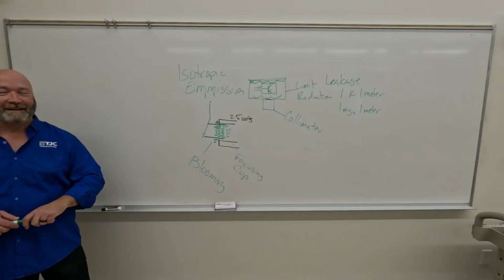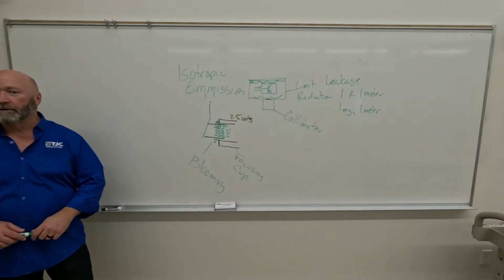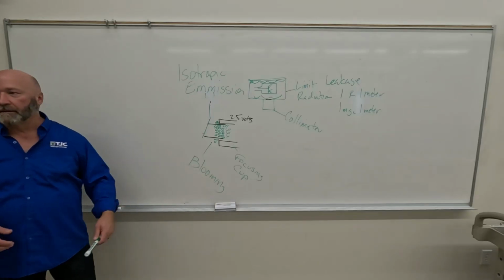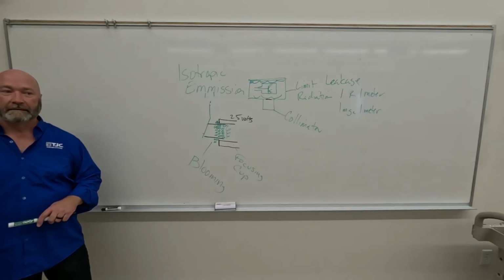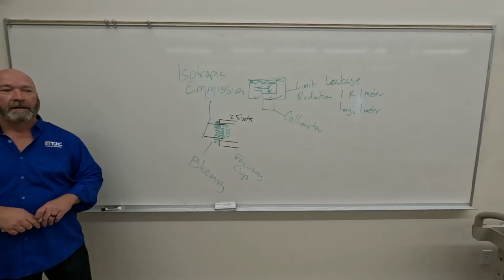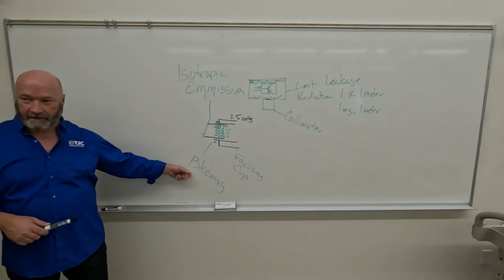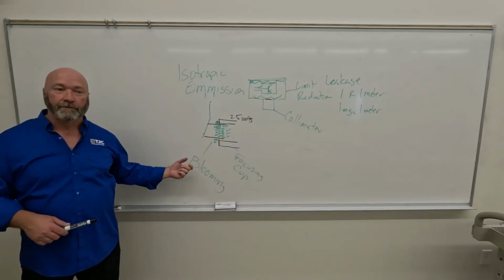I'm getting some looks like, I did that. You're creating a big space charge, and what you're creating is blooming, and you're losing sharpness of recorded detail. Okay, so for a lot of different reasons, your rotor time should be as short as possible. That's one of them, because long rotor times are going to give you blooming. It's going to create a lot of heat too. You're going to lose sharpness of recorded detail.